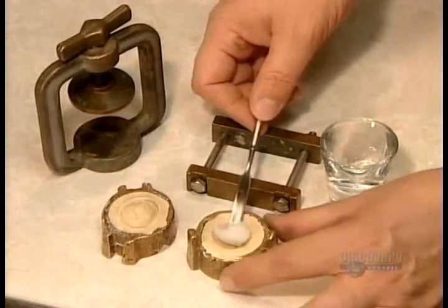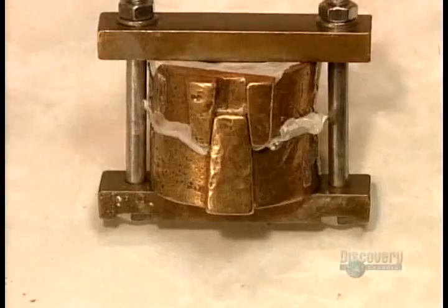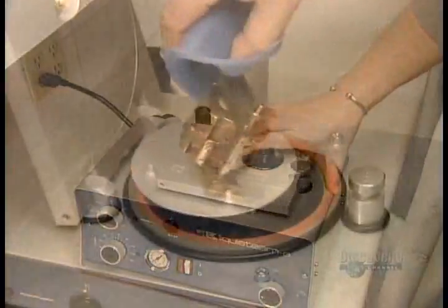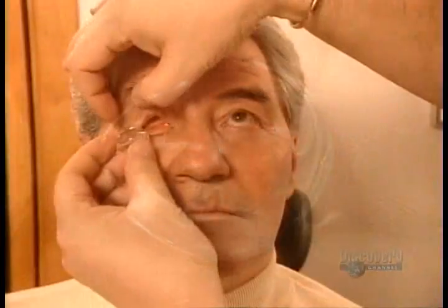Now they put a wad of acrylic plastic dough into the mould, lock the mould into a press, and submerge it in a high-pressure curing unit for 25 minutes. Then they cool the mould in cold water. Here's the original impression compared to the acrylic model they've just cast.